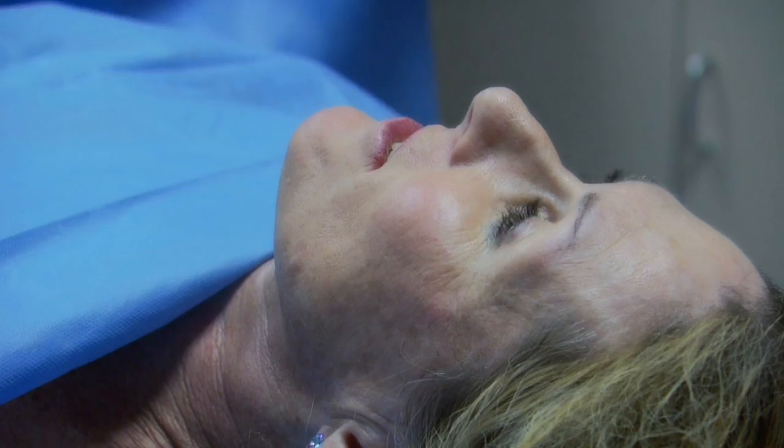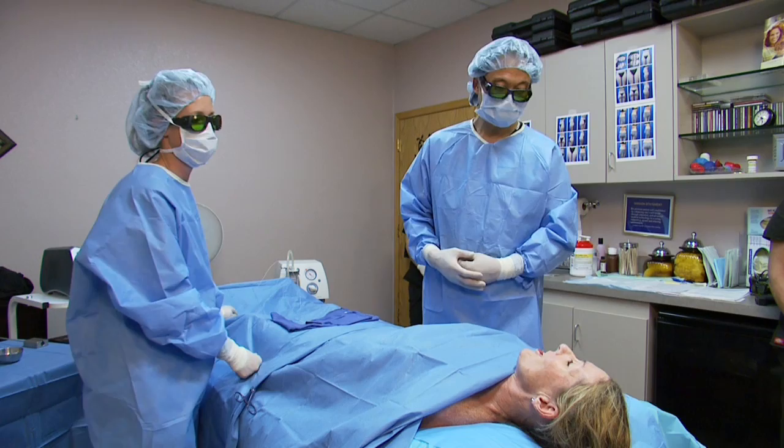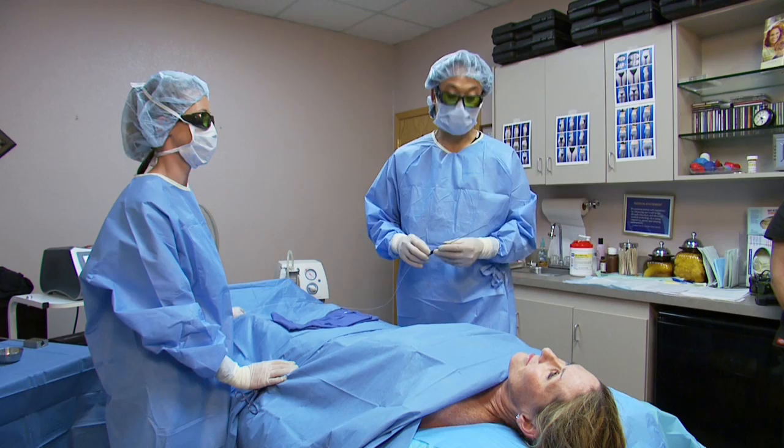We've just completed Candice's La Aveda laser body contouring and she's done very well. How are you feeling, Candice? Feeling great. Did you have any discomfort with the procedure? None. So Candice did great. Once again, we used the La Aveda 980 nanometer diode laser, and with this laser we were able to contour her flanks, her saddlebag area, as well as her inner thigh. We're very pleased with the results, and in a moment you'll see Candice walking out of our office.